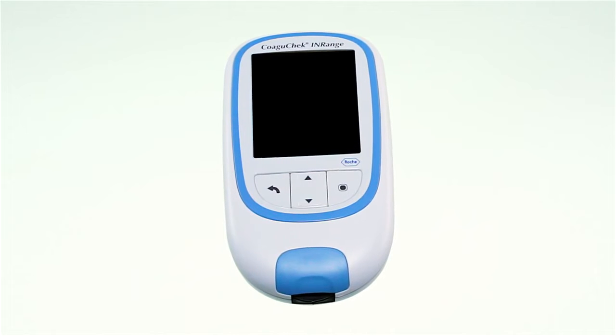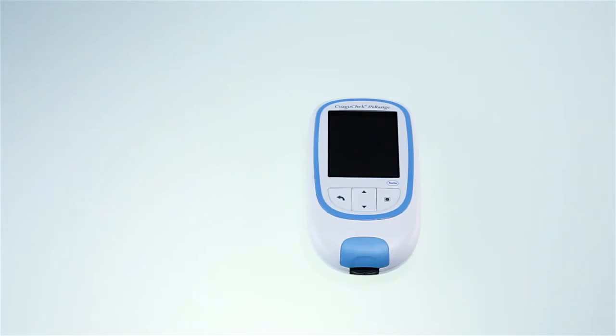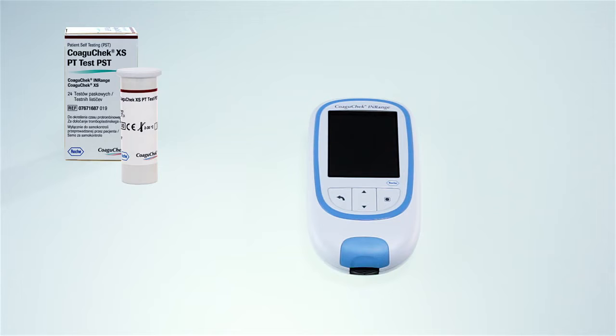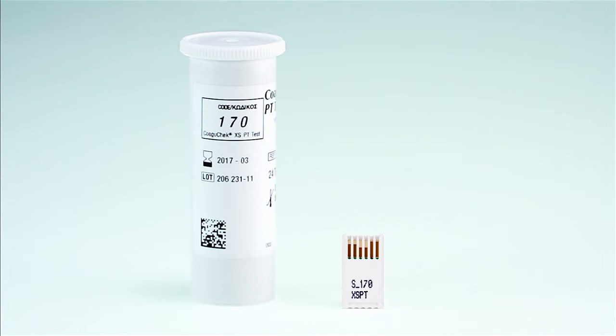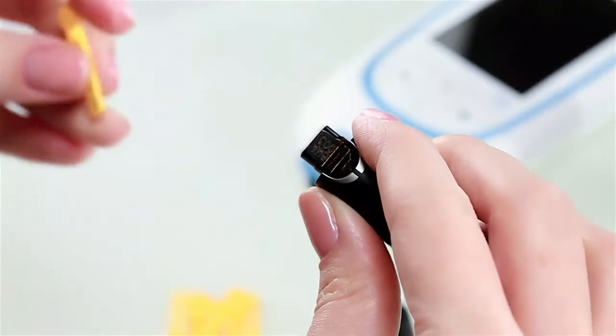Now you are ready to test your INR value. The first thing to do is make sure that you have everything you need to run a test: a COAGUCHECK INRANGE meter, a container of COAGUCHECK XS PT test strips and a code chip, a COAGUCHECK XS SoftClicks lancing device and a COAGUCHECK SoftClicks lancet, and a lint-free cloth or paper tissue. Have the test strip container at hand and make sure the code chip belonging to these test strips is available, or that the information has previously been stored in the meter.